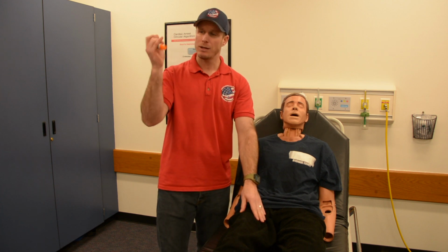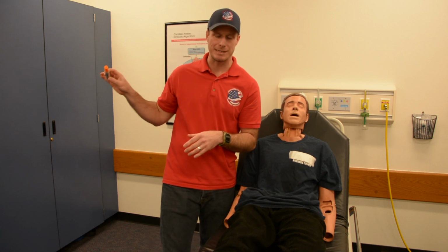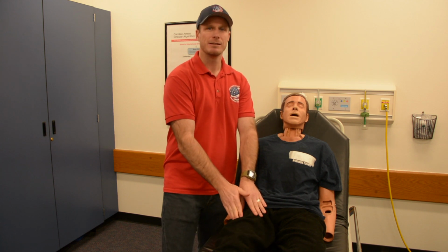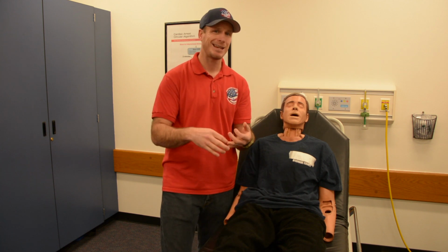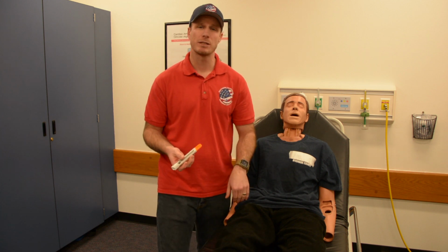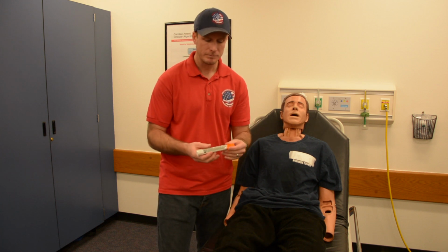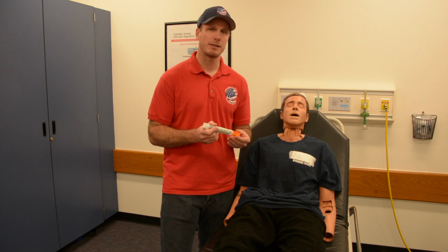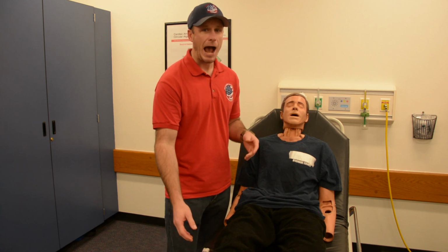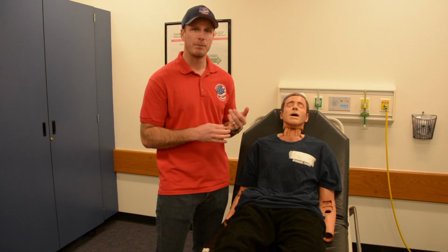After we're done with that, we're going to sharps this. This is now a sharps and needs to be placed in a sharps container. And we're going to massage my patient's leg for 10 seconds. So that 10, 10, and 10 rule is, again, 10 inches above the knee or 10 inches below the hip into the outer portion of the thigh. Hold in for 10 seconds in the patient's leg, massage for 10 seconds, and make sure this goes in a sharps container.